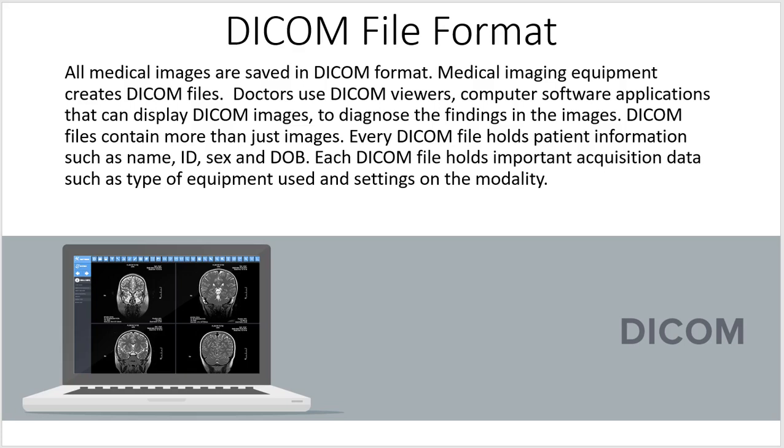DICOM file format. All medical images are saved in DICOM format. Medical imaging equipment creates DICOM files. Doctors use DICOM viewers, which are computer software applications that can display DICOM images to diagnose the findings in the images. DICOM files contain more than just the image.